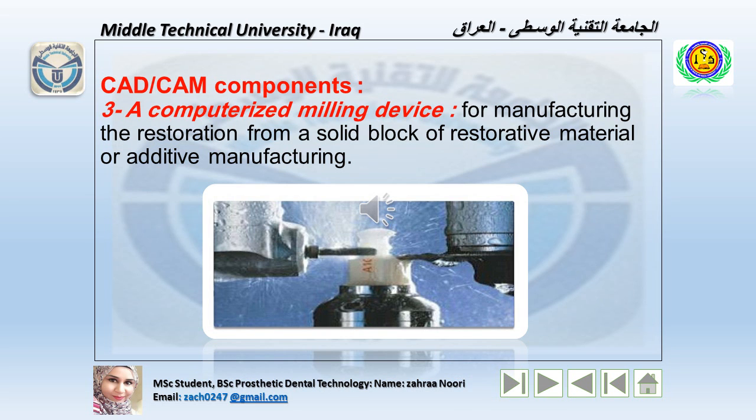We reached the third part of the CAD components, a computerized milling device for manufacturing the restoration from a solid block of restorative material or by additive manufacturing. This is the last phase of the dental CAD process. It involves developing a restoration from a CAD model into a physical part that undergoes processing, finishing and polishing before being inserted into the patient's mouth.